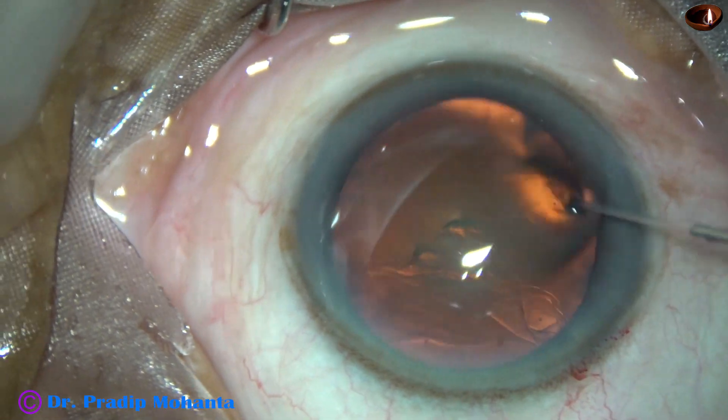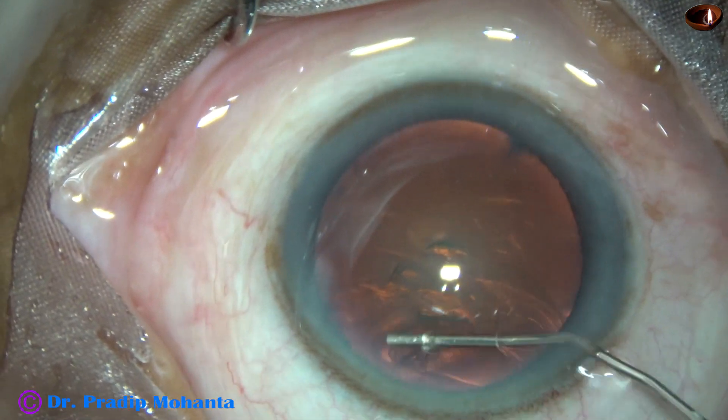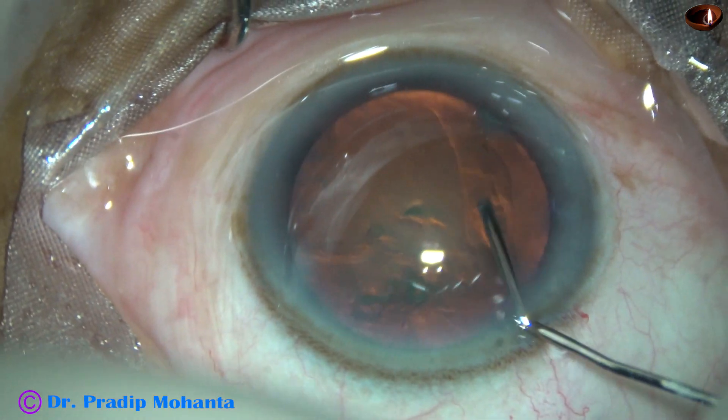Now, hydrodissection is done with a 27-gauge cannula and BSS.